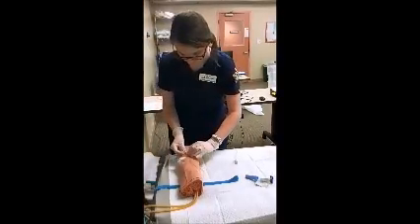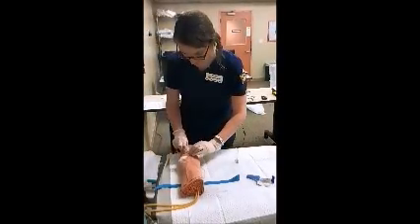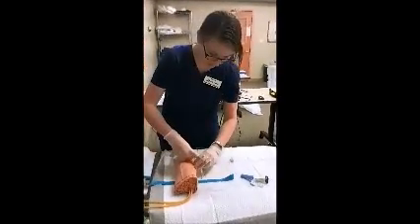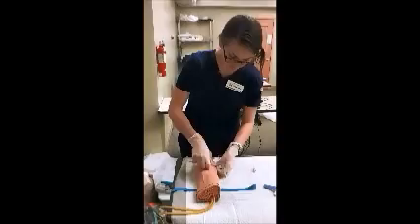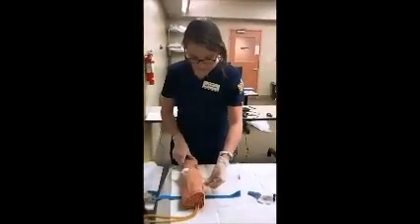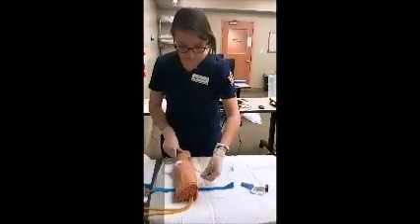All right. That way if you decide to wiggle around on me or feel like turning over in bed, you know, it won't get stuck anywhere. Thanks for doing that. No problem. I like to move a lot in my sleep. Oh, a lot of people do. I'm also a wiggler. I totally understand.